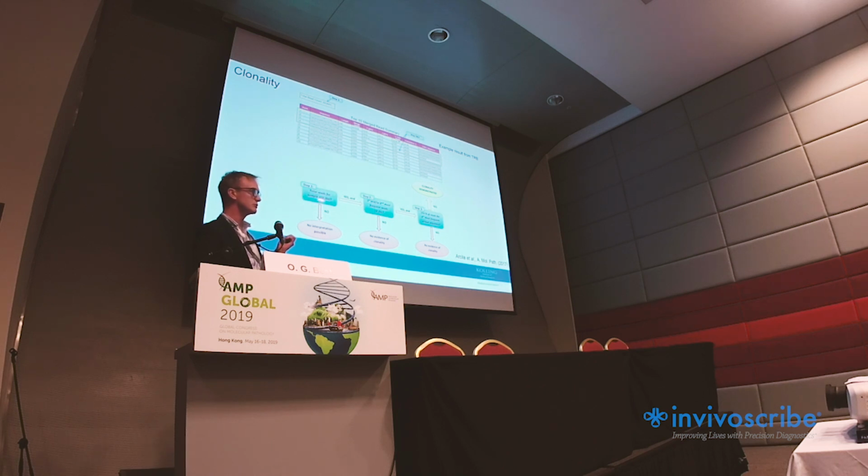That is a quality control step. We then looked for the first or second most frequent reads as being greater than 2.5%. If that rule was met, then we looked for the first or second reads being greater than 5 times the fourth most frequent unique read. And if that third rule was met, then we deemed that to demonstrate clonality.